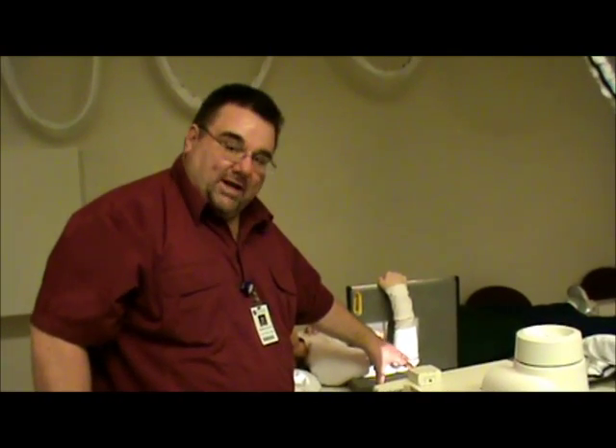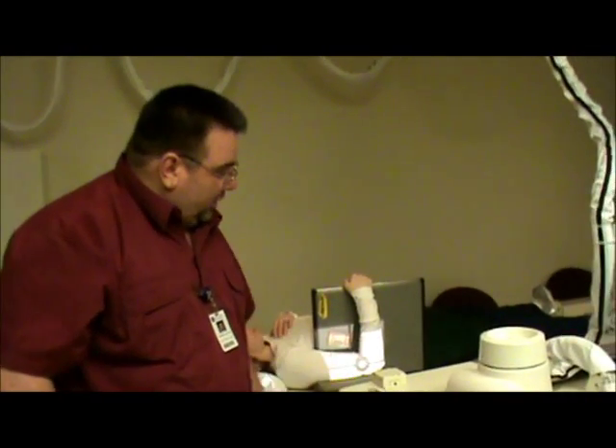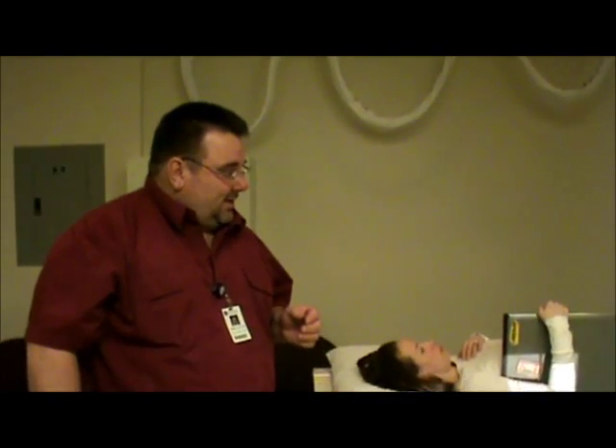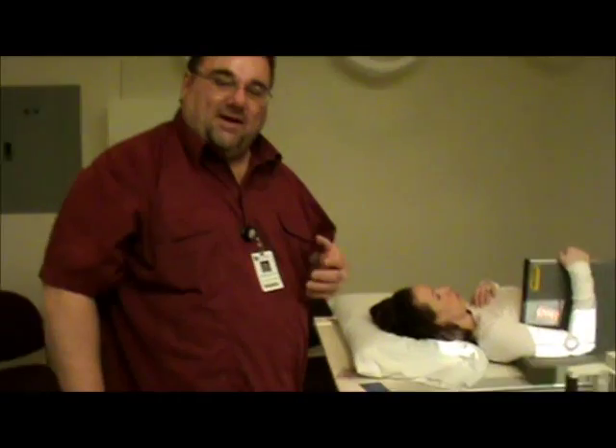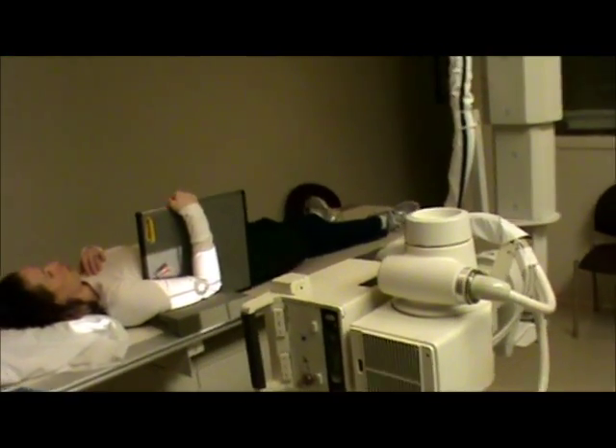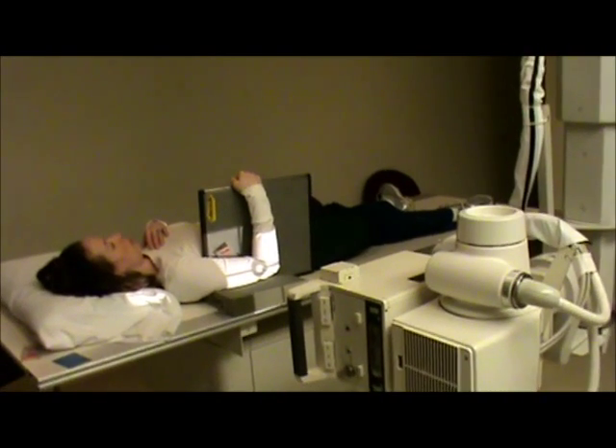We have the bend of the elbow and the joint space — because the humerus is a long bone, we have to have both joint spaces, and we are including that. Our technique on this is going to be somewhere around 8 mAs at 55 to 57 kV. And this is our shoot-through trauma humerus view.